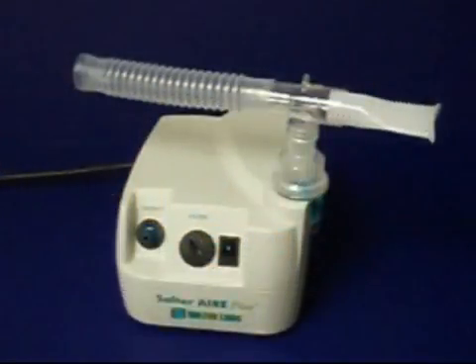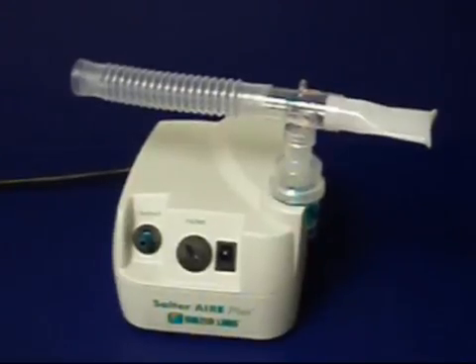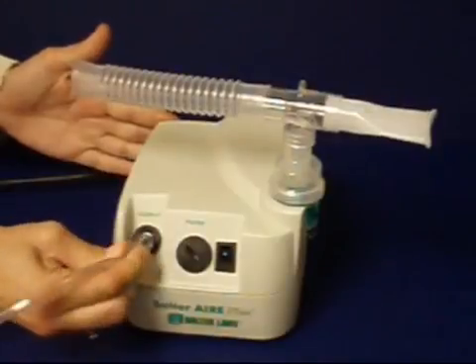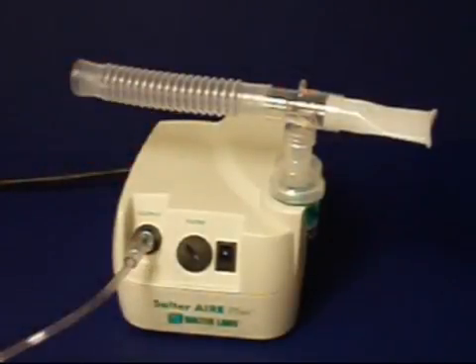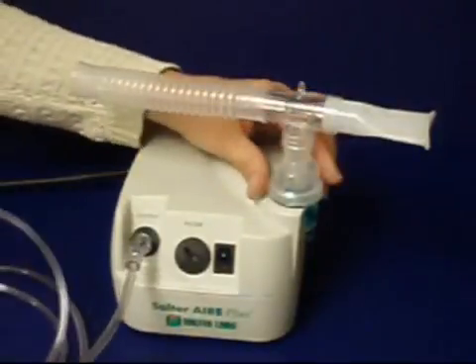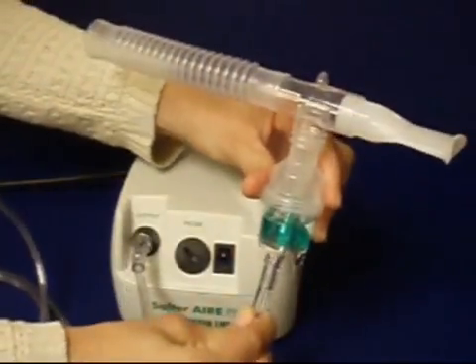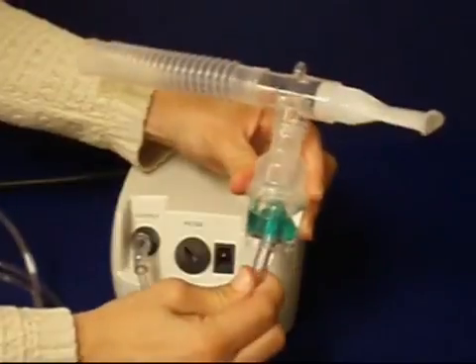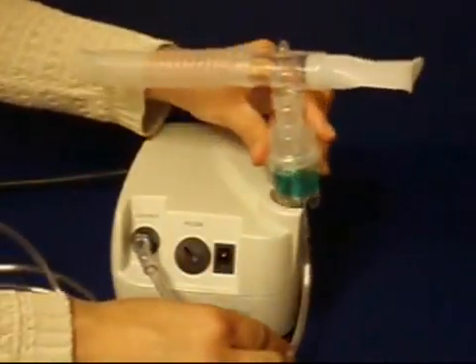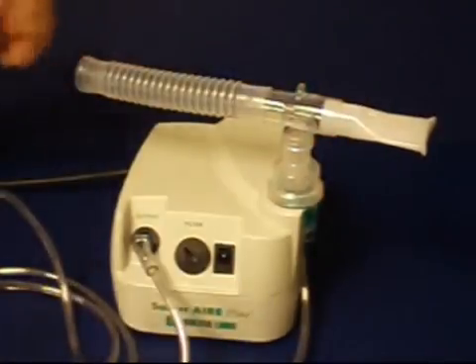Continue by attaching one end of the air supply tube to the green nipple outlet on the front of the compressor. Both ends of this tube are the same. With the nebulizer filled and resting in the compressor docking station, attach the other end of the air supply tube to the nipple outlet on the bottom of the nebulizer cup.